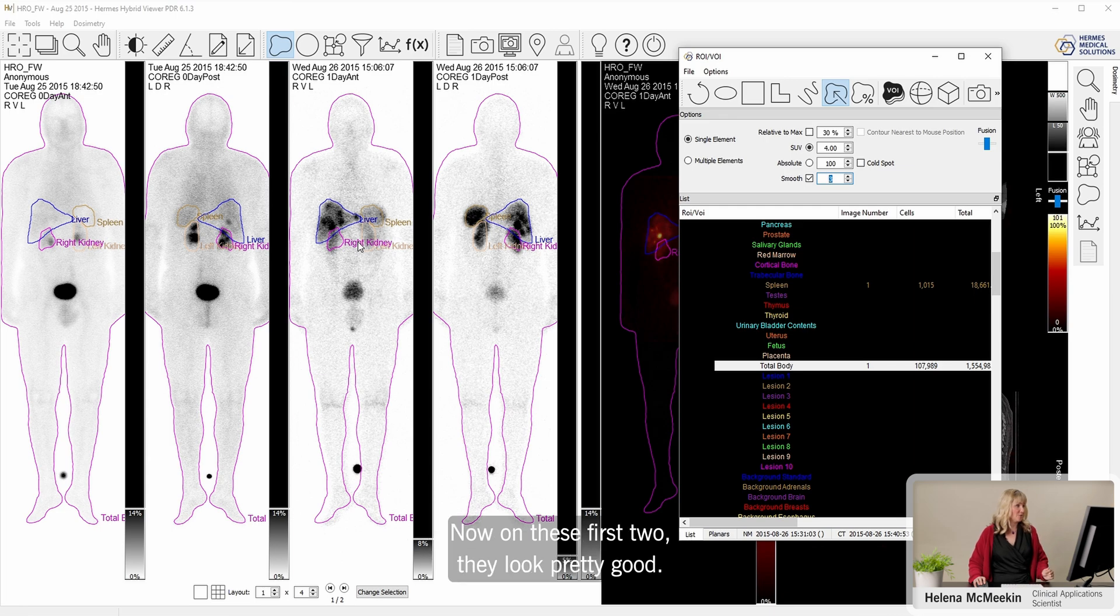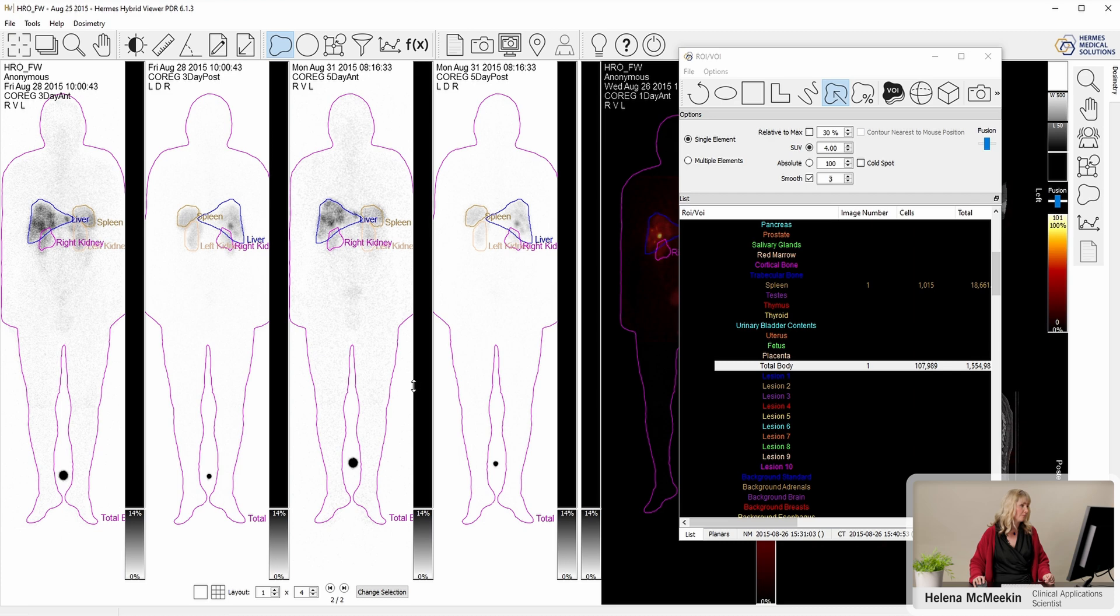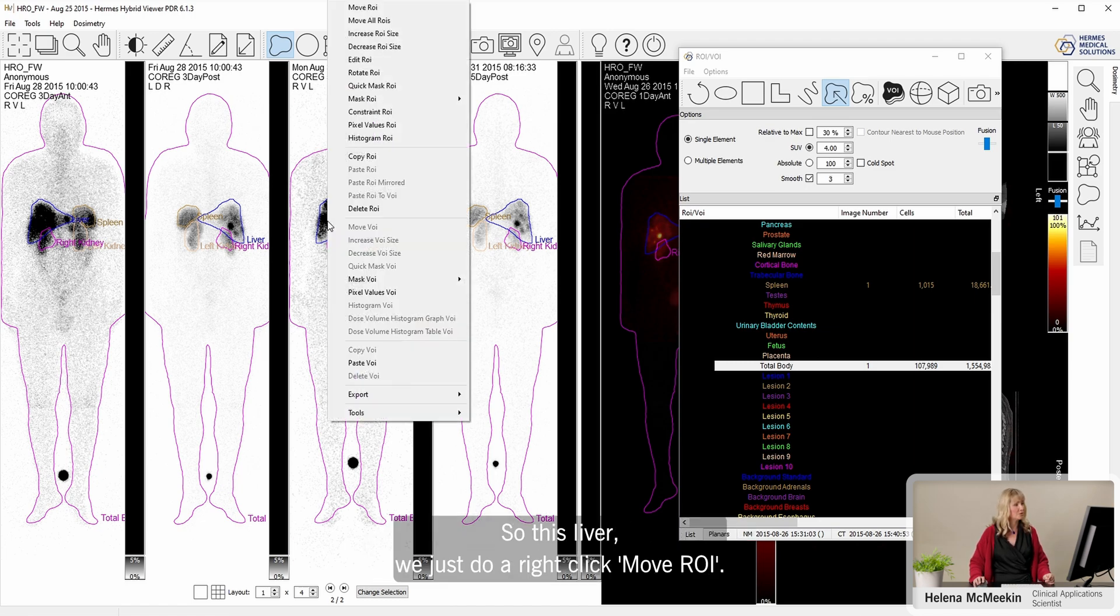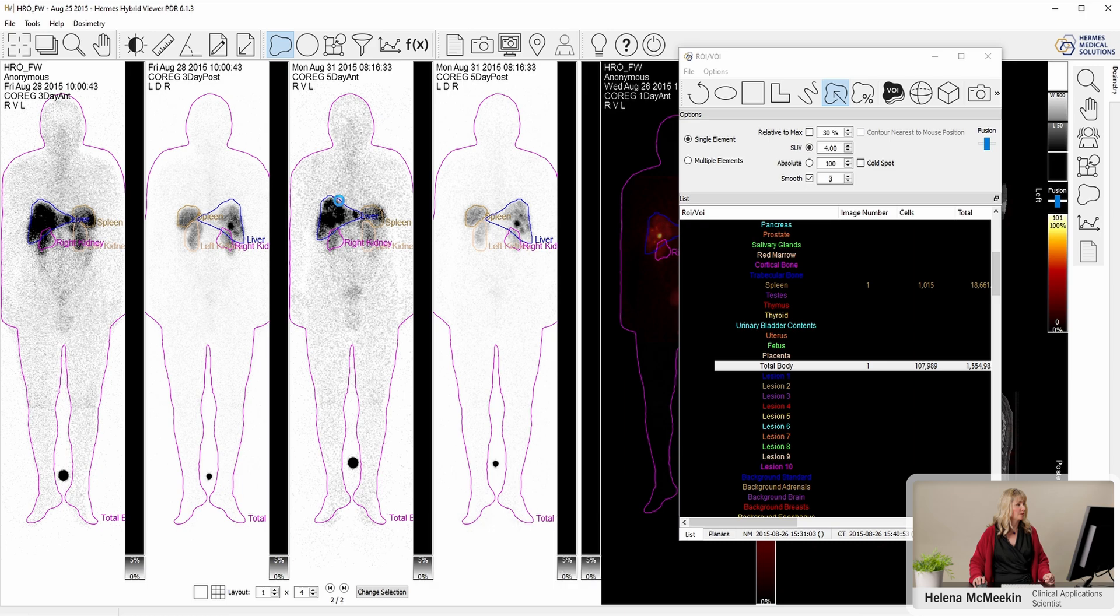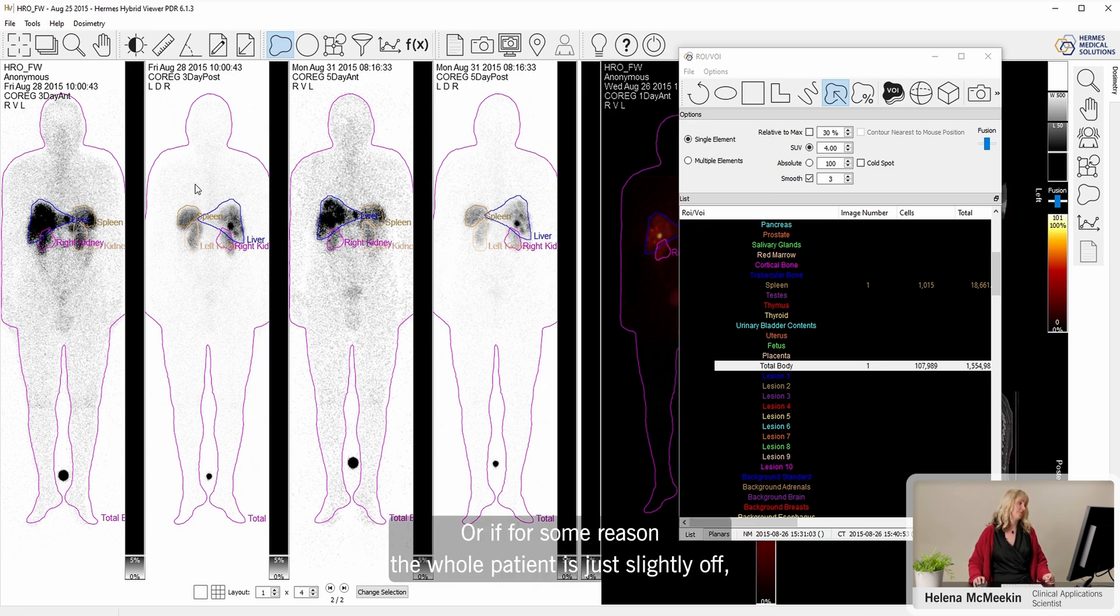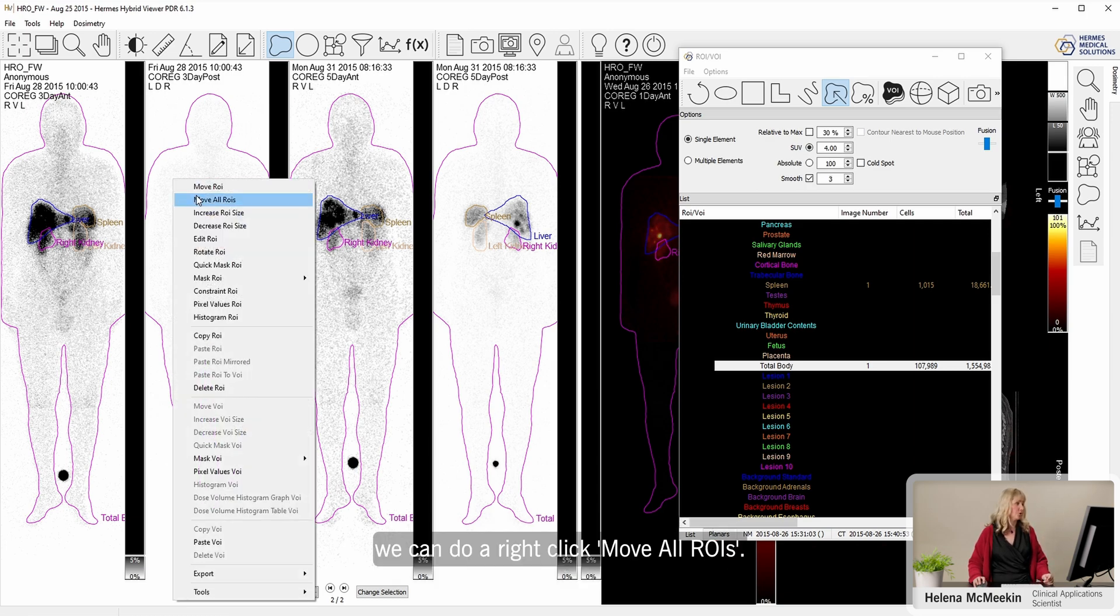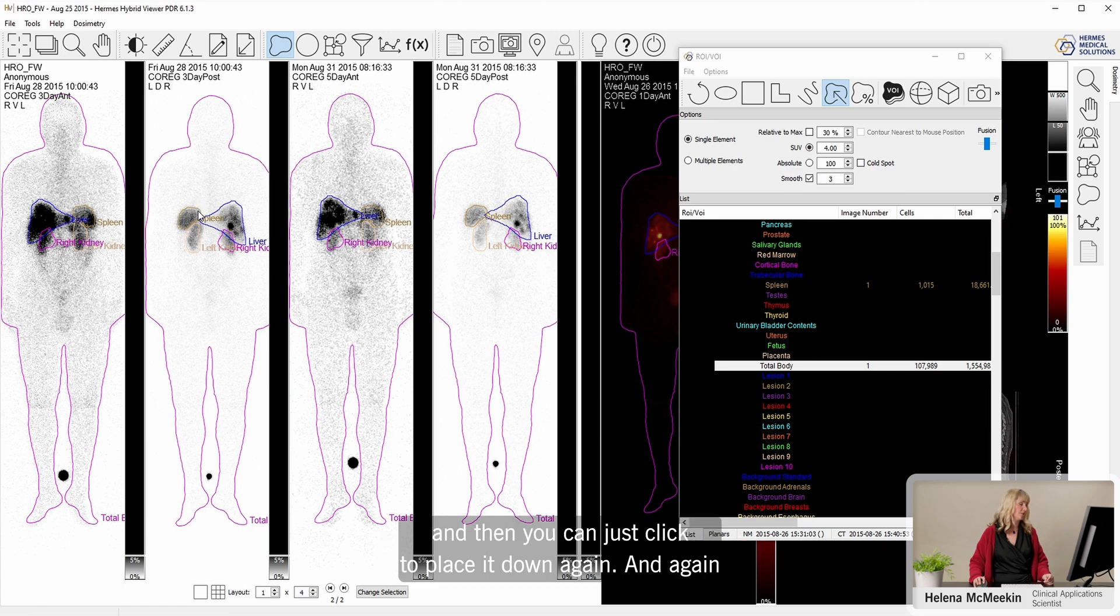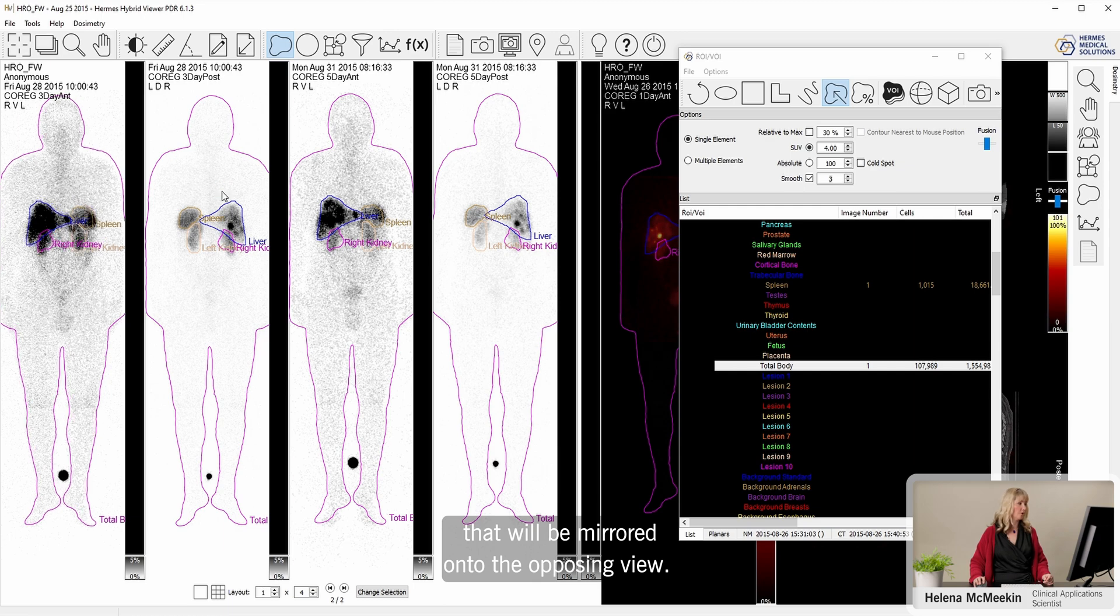We can see the regions now on these first two, they look pretty good. Let's have a look at the next two time points. Maybe we need to make a few changes here. We can just move them region by region if we want. So this liver, if we just do a right-click, move ROI, then we can just grab it and replace it as we want. There's a small pause while the application updates the partner region. Or if the whole patient is slightly off, we can do a right-click, move all ROIs, then the whole set will come with you. That will be mirrored onto the opposing view.